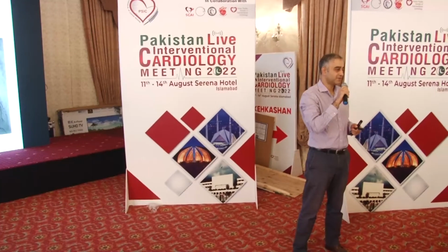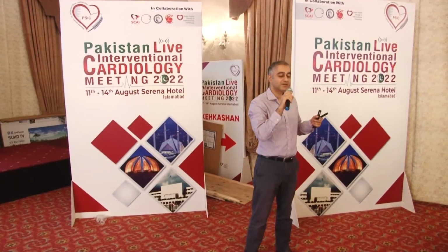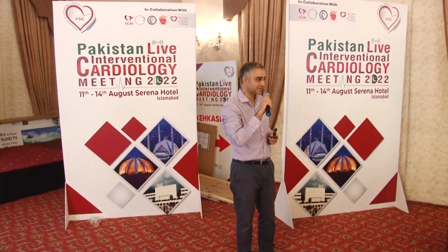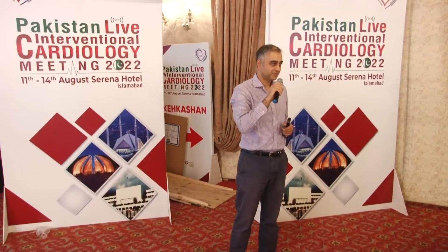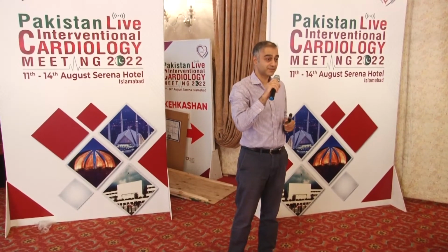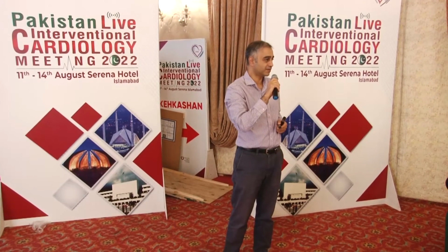Because if I walk into a room wearing dark glasses, I'm not going to be able to see very well. If I put on some spectacles, I might be able to see better. That's your angiogram spectacles. But if you put on magnifying glasses, then you'll see even better. And that's where the IVUS comes in. The IVUS is kind of your magnifying glass.